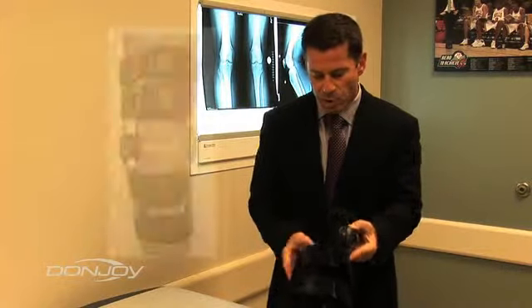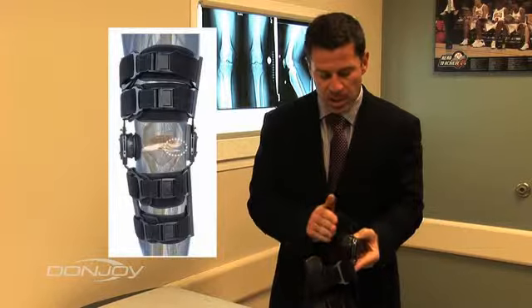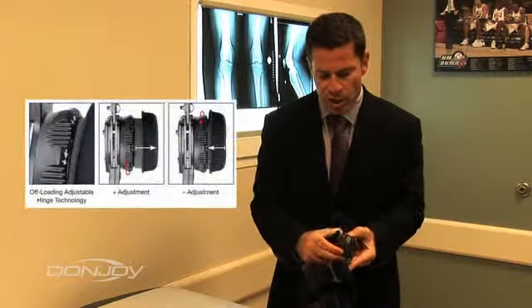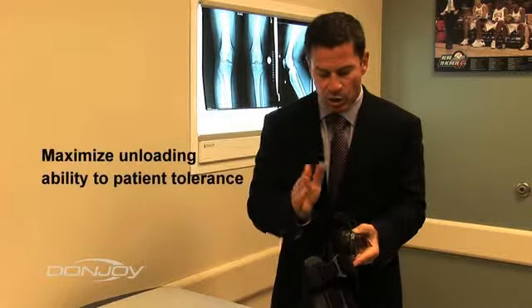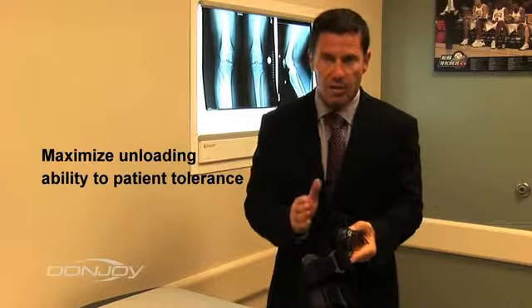So if I have a medial procedure, the brace would be worn such that the pad would be situated on the lateral side of the knee and essentially increase the pressure on the lateral side of the knee just to the point that the patient begins to have any degree of intolerance to it. So I'd like to maximize the unloading ability to patient tolerance.